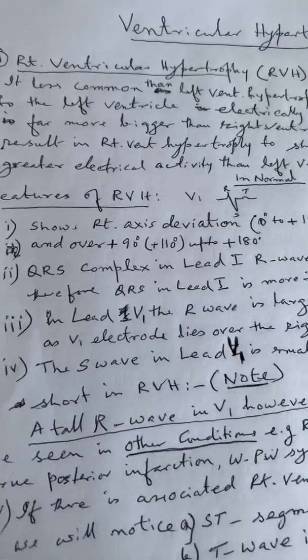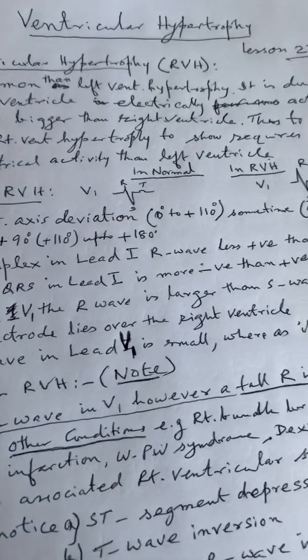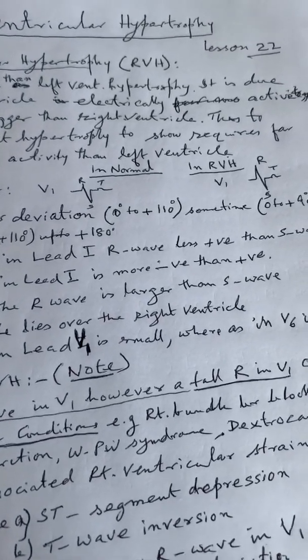Now, right ventricular hypertrophy is less common than left ventricular hypertrophy.